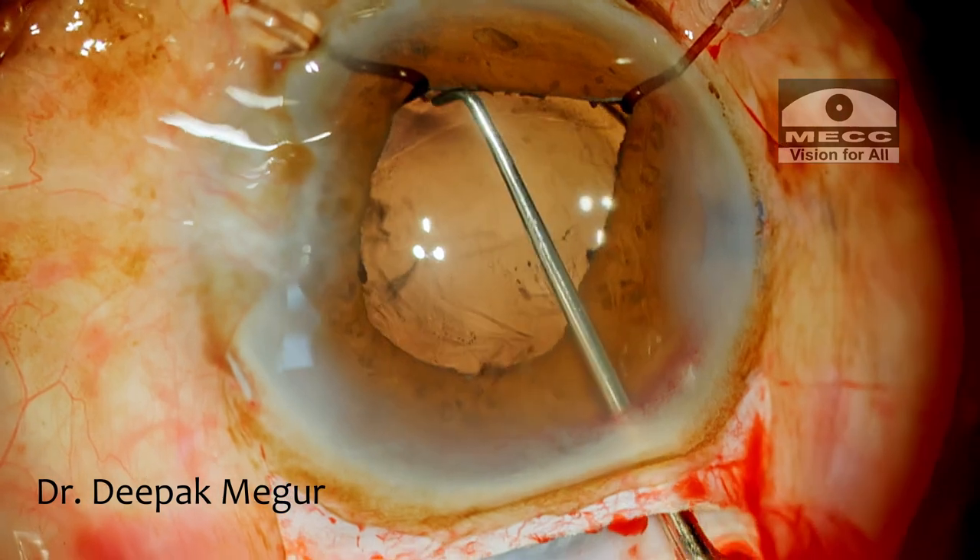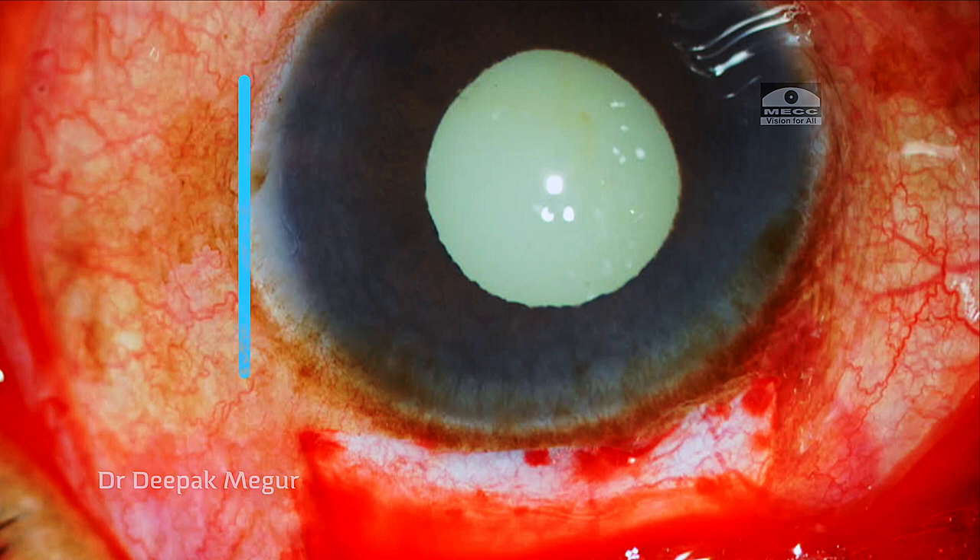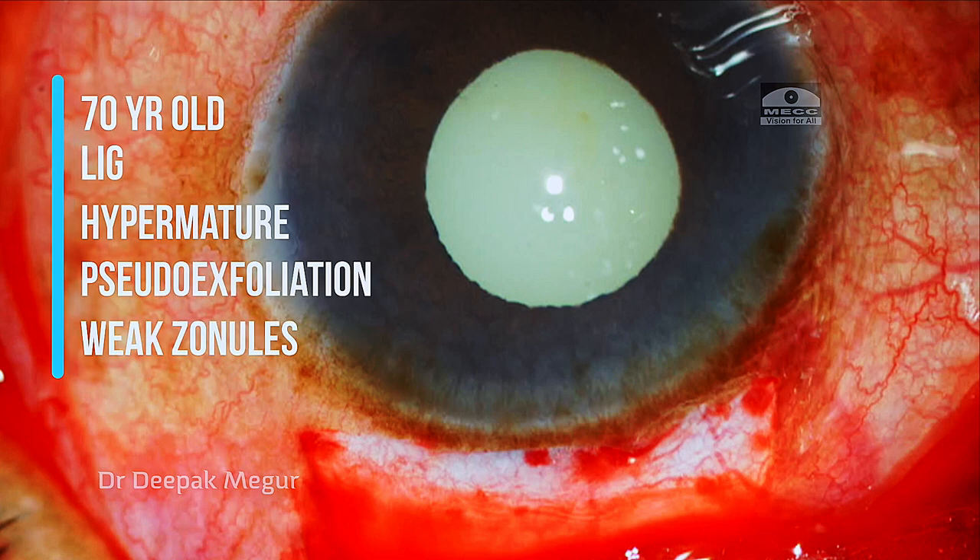The lens is implanted and the hooks are removed. Moving to the next case — this was done four years back and it shows my inability to read the situation well enough.